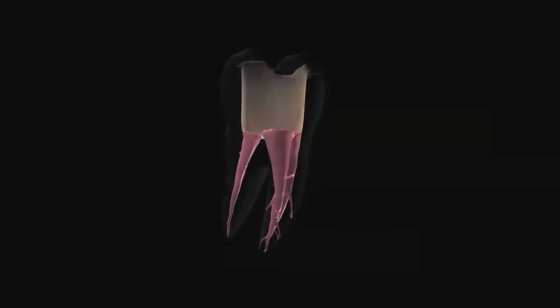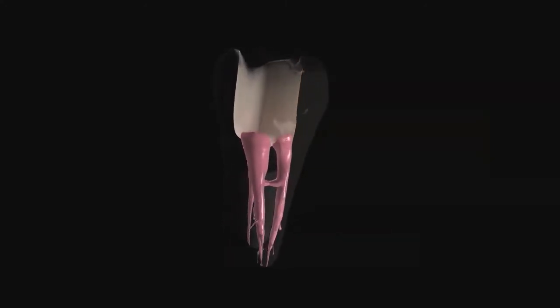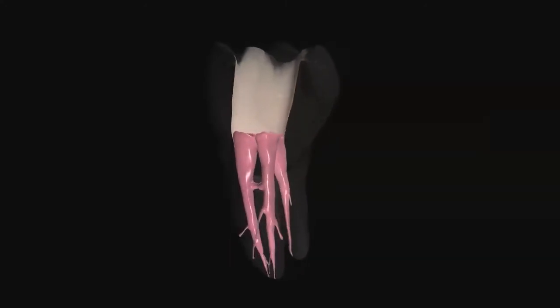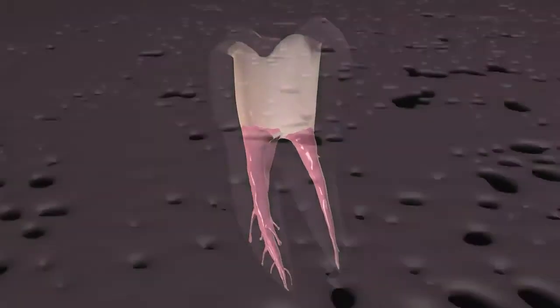Gutta-core. Cross-linked gutta-percha core obturators. Everything you know and trust about gutta-percha with the convenience and performance of a dense-fill Tulsa dental specialties obturator.